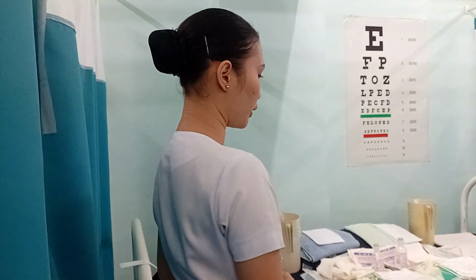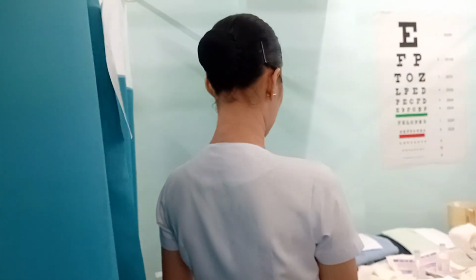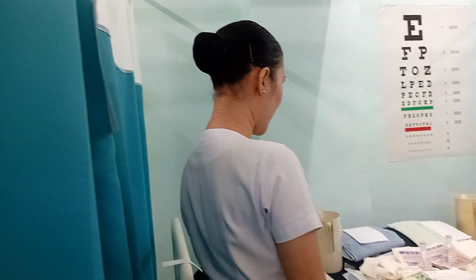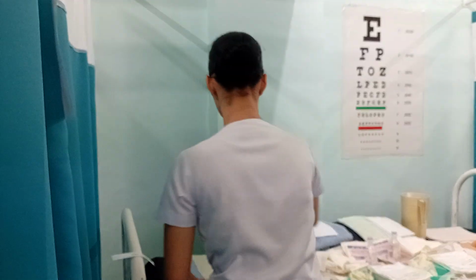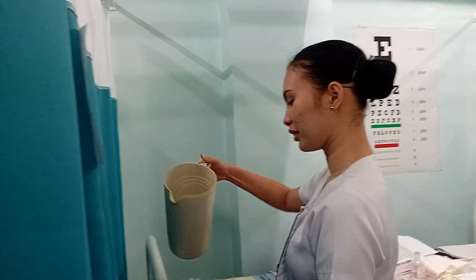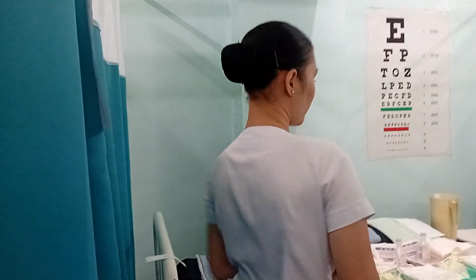Then after, we are going to assume that the patient is already covered with the blanket, and the waterproof pad is already under the blanket. And then we are going to check for the water temperature. And then we are going to wear gloves.